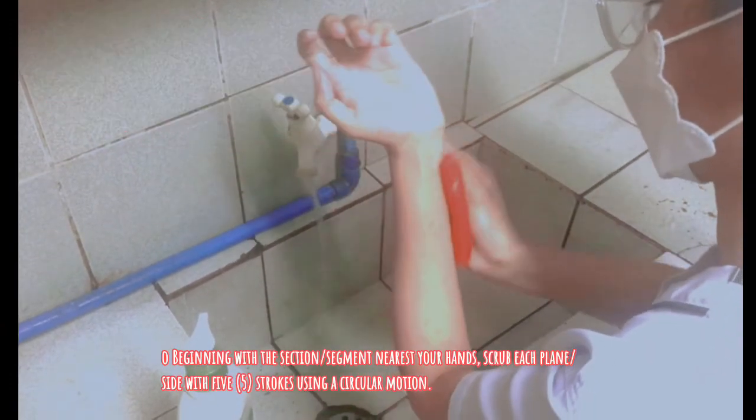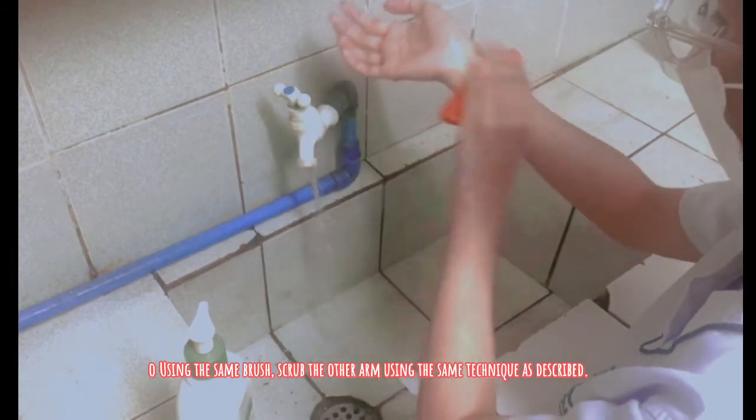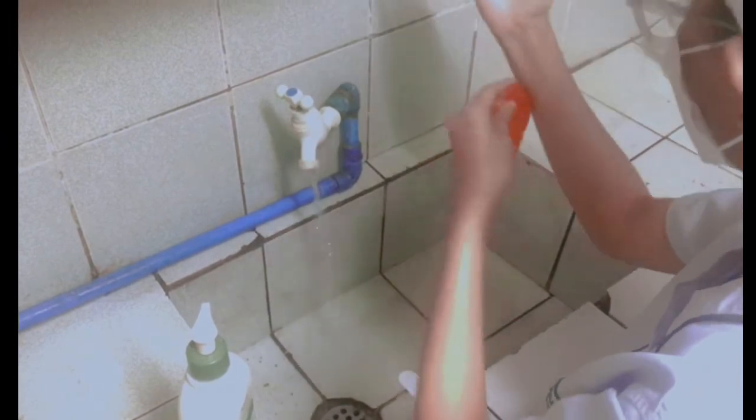Scrubbing individually and thoroughly allows all areas of the arms to be washed properly. Dividing into areas or planes allows for easier and more organized cleaning in all areas of the arms. Using the friction or rubbing motion facilitates the removal of microorganisms mechanically.